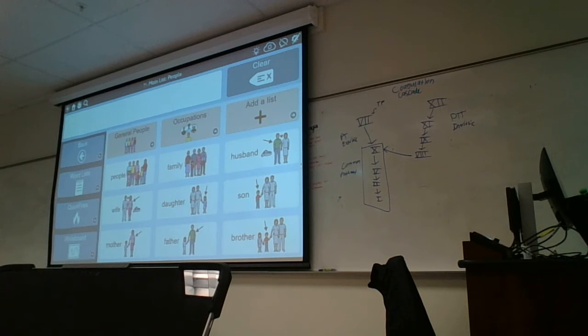Yeah, and we'll take a look at a regular core page set just to show you the differences. Right. So this would be an advantage for someone with aphasia since the line drawings have more detail and have a little bit more meaning compared to when we did our activity where we had a guess. One of the groups had, I copied the home screen for SnapCore, and we did an activity where I whited out the words and they had to guess what the symbols were, but they were PCS, so yeah.